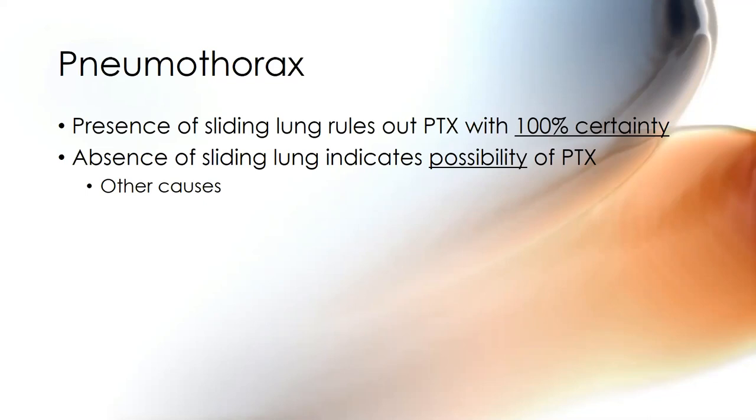Death, definitely. There should be no spontaneous respirations in the pronouncement of a patient who is dead. So there is no inflation or deflation of the lung. So that's correct. Pneumonia, that is a very good one. At that location, your lung is full of schmutz. The air cannot get to that left lower lobe. It just can't get there. And so I put my probe on there and I don't see lung slide, but I see B-lines. So yeah, that one's harder.